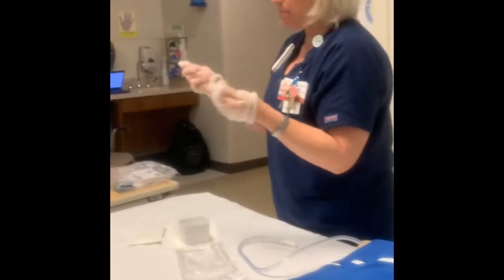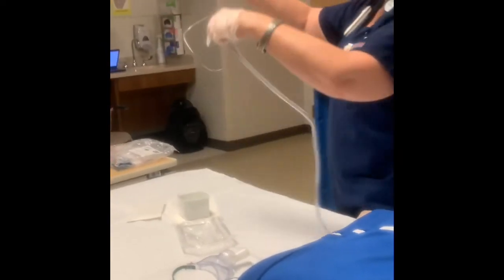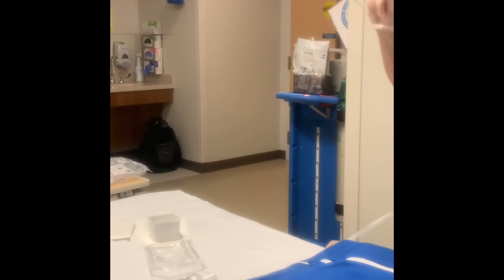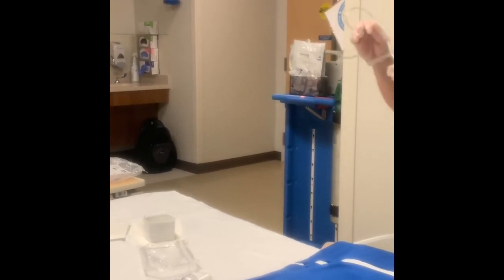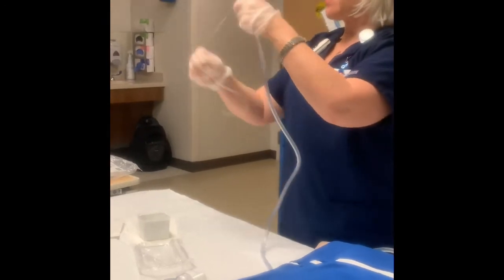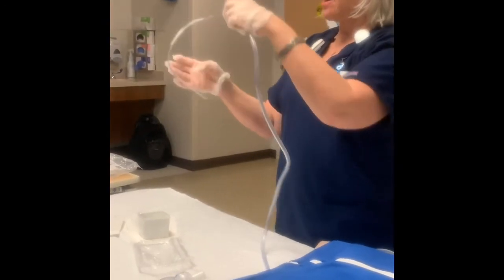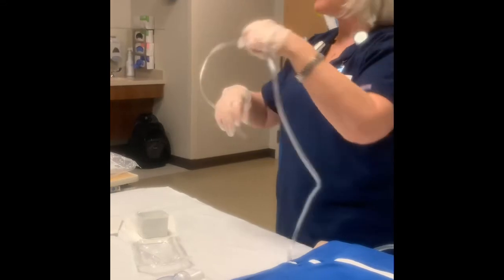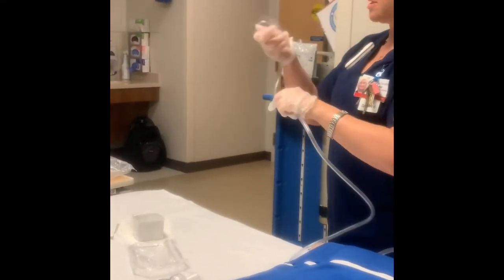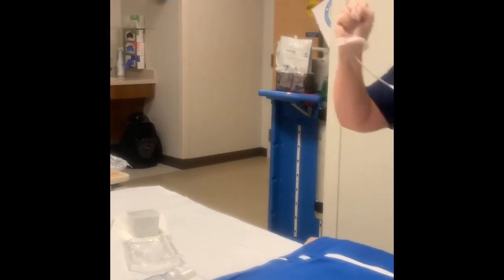Okay, I don't have saline, but anyway, so I'm gonna leave it right here. I usually like to wrap it around here just a few seconds because if I don't, and for purposes of this, I'll break sterility on this here. Because what I've had happen before, if I don't do that, I'm doing this and it ends up touching my arm or something like that. Okay, so I'll just do it like this just to kind of hold it a little bit more stable here.